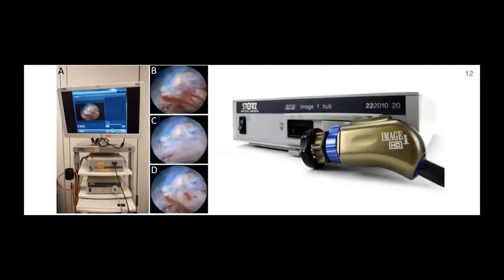This is the equipment we generally use during our oral microsurgical procedures aided by endoscopy. For me, the Telepack system is an extremely comfortable piece of equipment to use in the dental operating room. In this case, the tower includes a monitor, a keyboard, a xenon light source, and a camera system with a digital image processing module. The image can be saved as stills or video file for research or legal history, for example.